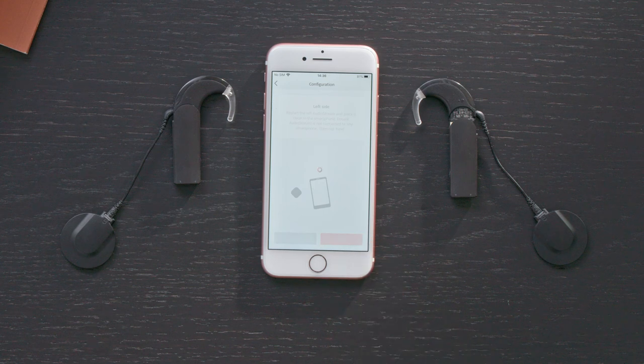If it fails to configure, move the AudioProcessor closer to the phone. Slide the AudioStream cover off and on and press Try again.